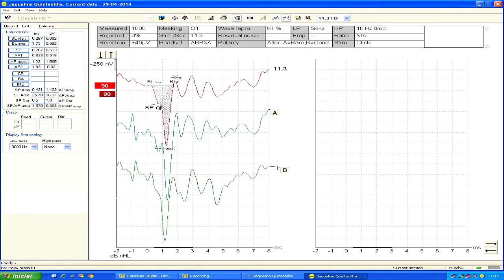An AP latency difference of 0.38 ms or higher is considered abnormal, as proposed by Margolis. In this case, it is normal.